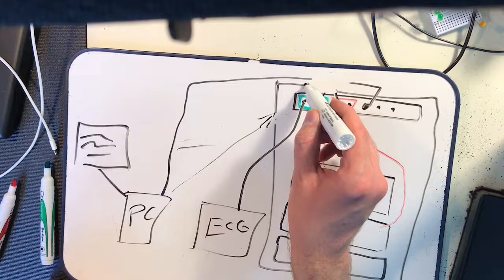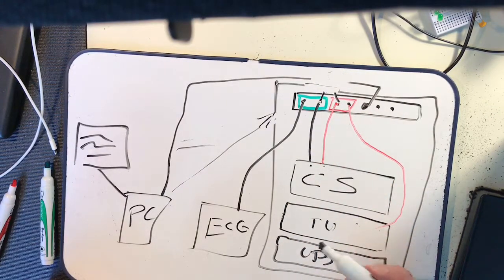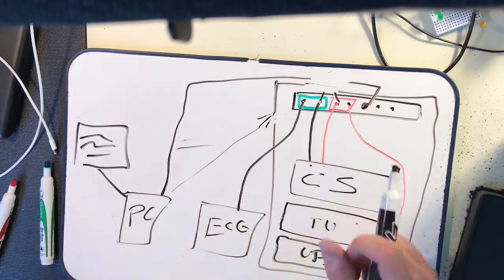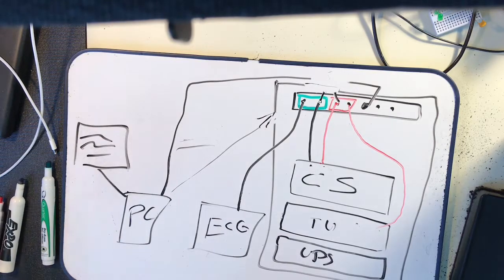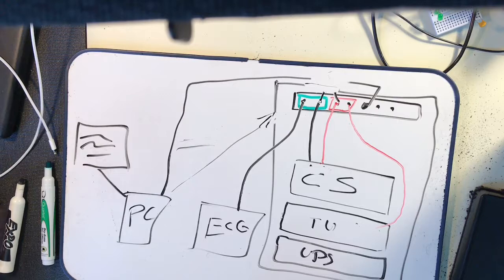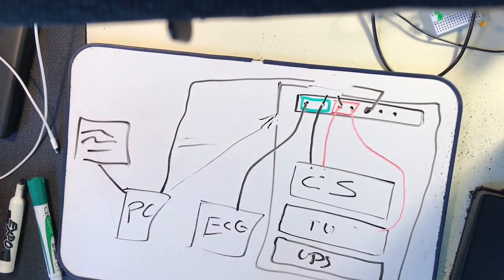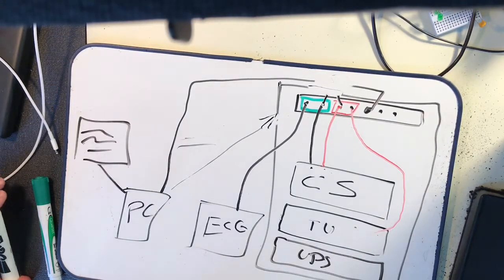And that's sort of how it's supposed to be in the documentation for the telemetry unit. But I'll probably do another video on how to set up the switch in particular, but hopefully that gives a better example of what these are used for. If you don't 100% get it, don't worry about it. It's rather advanced networking stuff. But in order to set these machines up, you need to use VLANs, and this will show you at least what VLANs are.